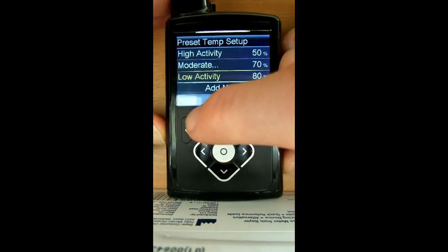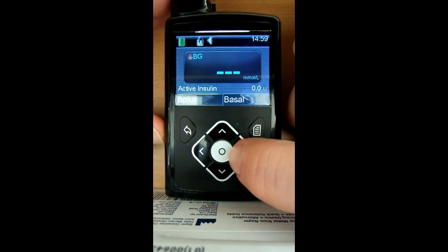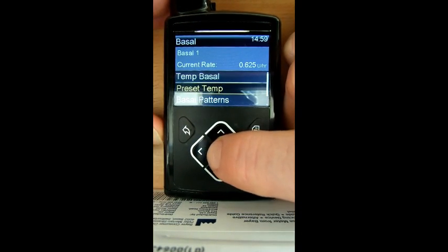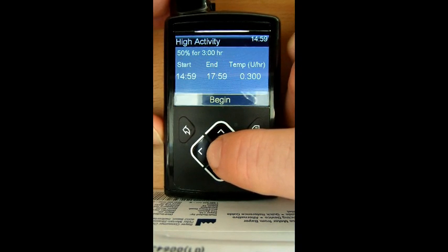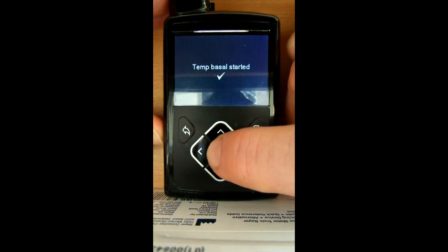Let's see if they're easy enough to use. If I just go straight into the basal menu, preset temporary basals are there. If it was a Wednesday night, bang that on — it tells you how long, it tells you when it starts and when it's going to finish, and at what speed that temporary will knock it down to. So it's gone from 0.6 to 0.3.